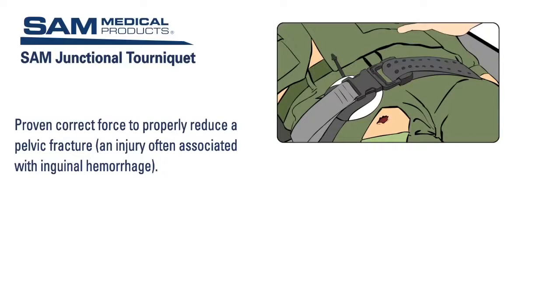The secured belt provides 150 newtons of circumferential force to the patient's pelvis, which is the amount of force proven to properly reduce a pelvic fracture, an injury often associated with inguinal hemorrhage. Now let's watch a real-time application.